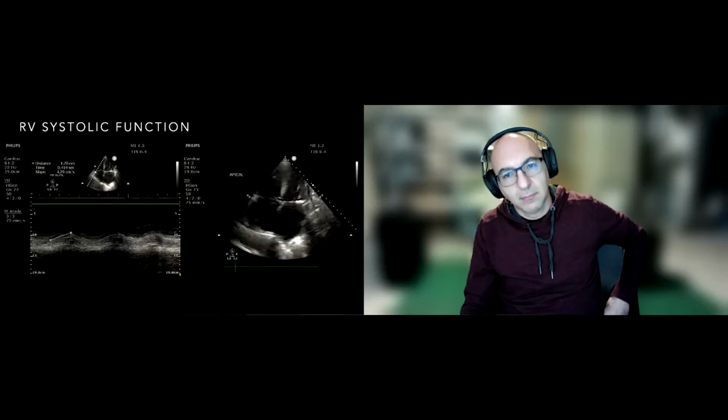I guess in the ED there are a lot of other ways of measuring it. For the RV/LV ratio here, it might be a little bit foreshortened on the LV. My memory of it wasn't ginormously huge. This one makes it look a little bit big, but I certainly would say there's probably some evidence of increased RV size, right? So maybe some chronic RV strain in this patient.